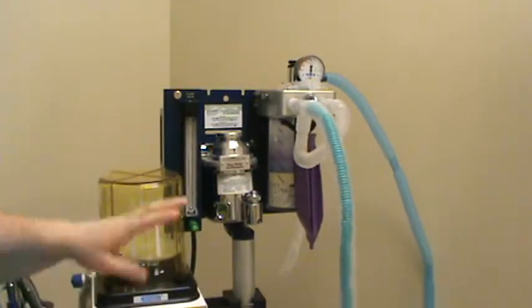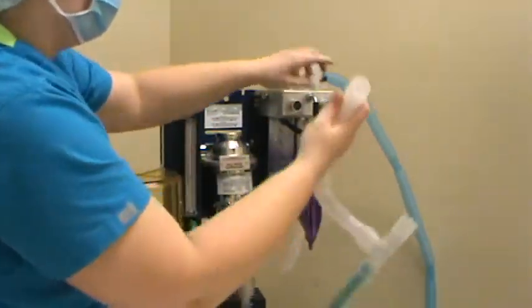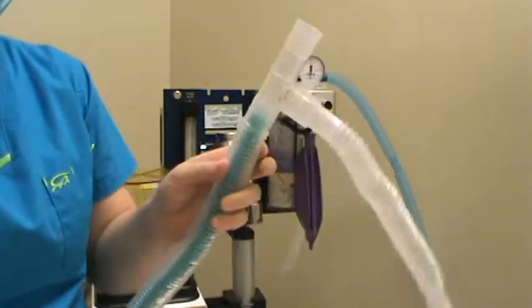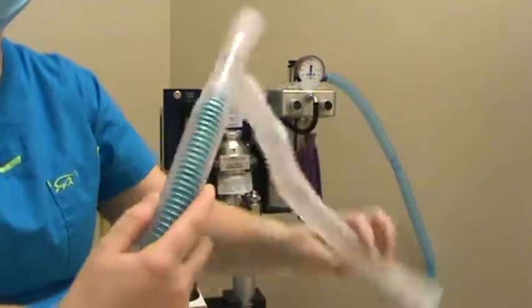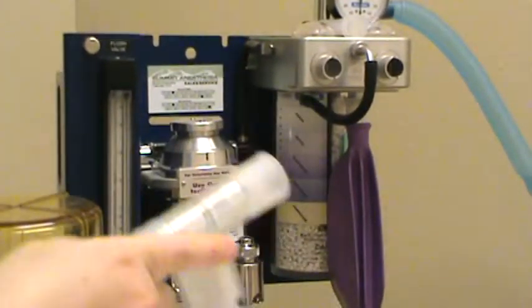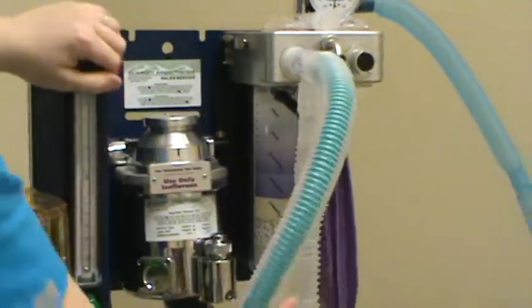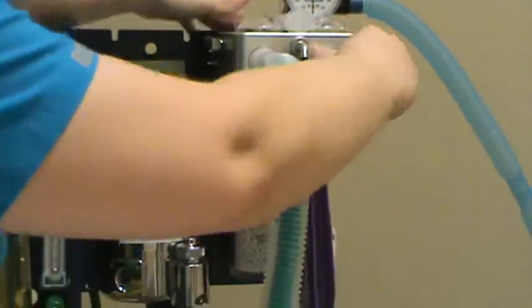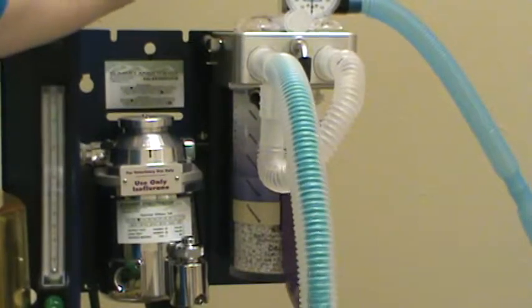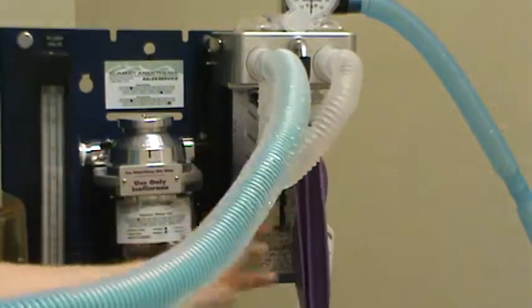For our patient today I've selected our tube, but I'm going to show you how to assemble this. We have our unidirectional inhalation-exhalation that goes up here on our machine. We have this little fresh gas outlet closed, our inhalation, our exhalation, our pop-off valve open right now, and we have selected an appropriate size bag here. This is the one liter bag.